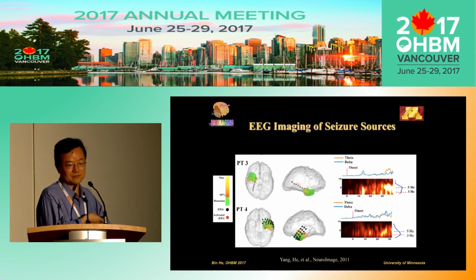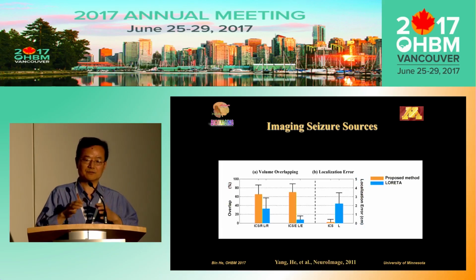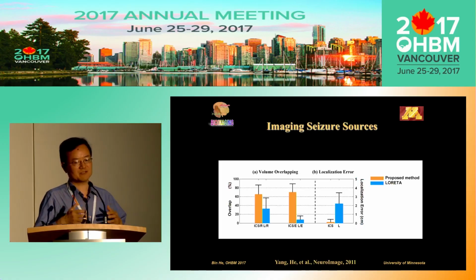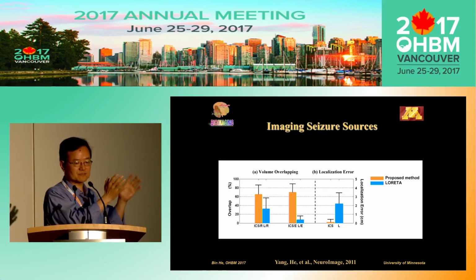Here is a comparison to the intracranial, direct recordings. You could certainly use a weighted minimum norm method such as LORETA directly to do the source imaging during the seizure.